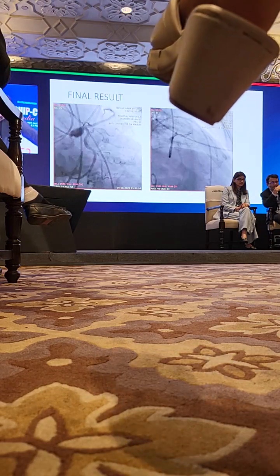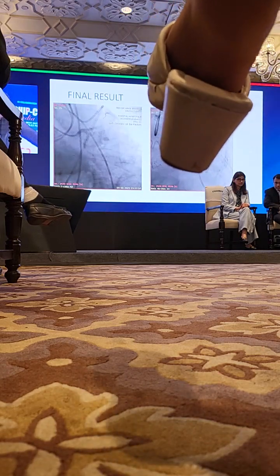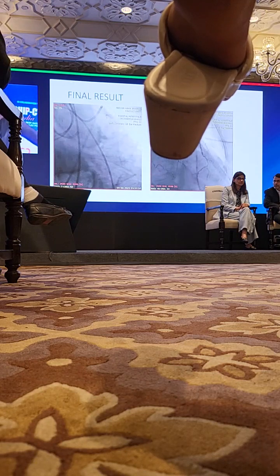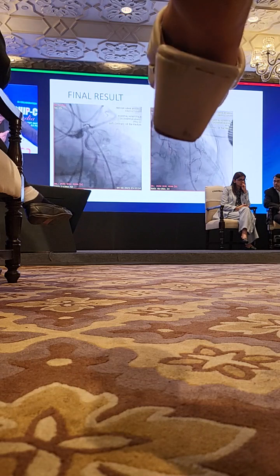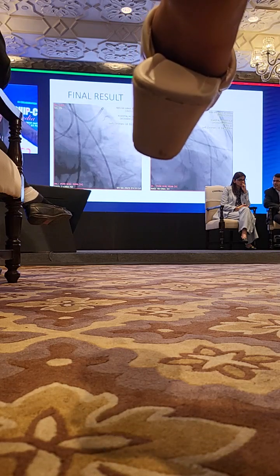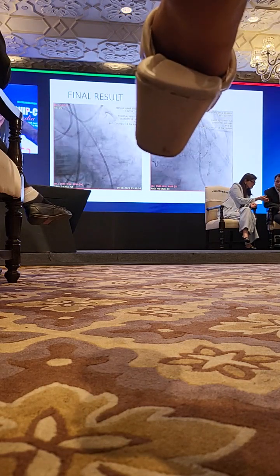Okay, so this is how the patient went, but the cause of the hypotension was found later on the CT. The next day the CT was done, and there was actually a peritoneal hemorrhage. So what probably happened is that when the pericardial drainage was done, some vessel must have been hit. It was not a retroperitoneal hemorrhage, it was probably a peritoneal hemorrhage which was leaking and caused all that hypotension.